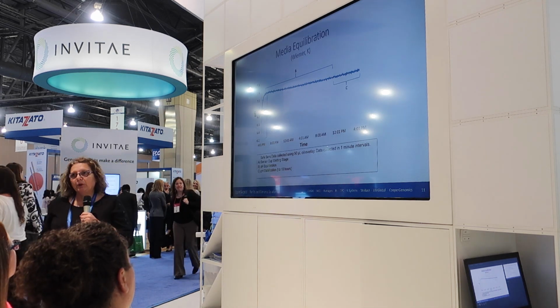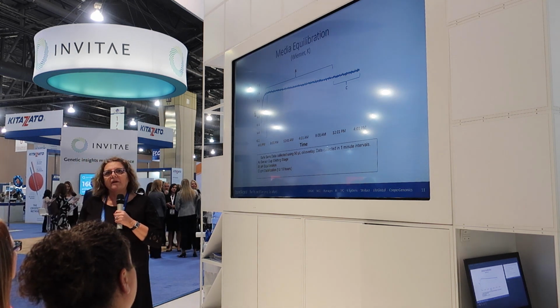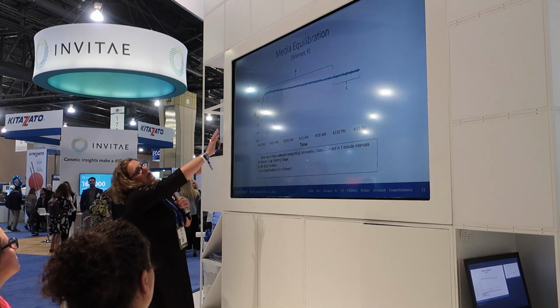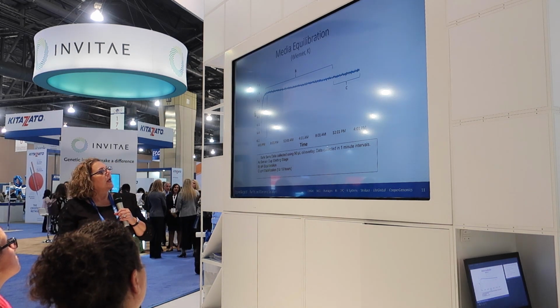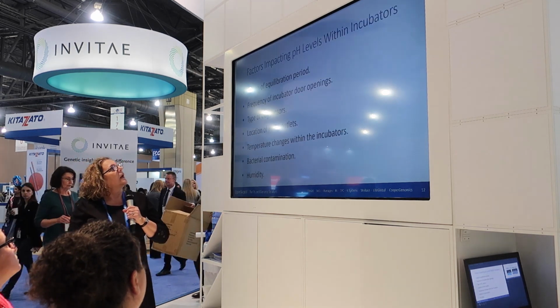This is a slide that Klaus Wiemer kindly let me use, and it's really a graphic of what we're talking about. This is how long it actually takes for media to reach stabilization, going through all three phases that Jason talks about.